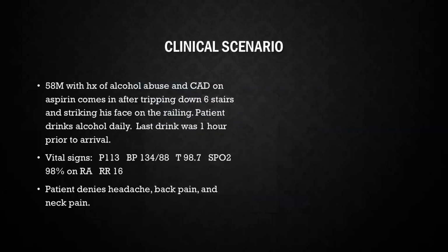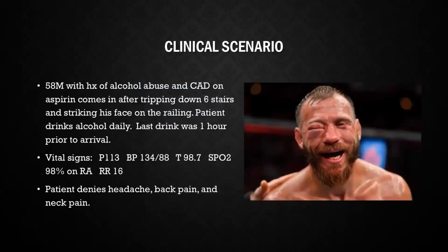So let's go back to our clinical scenario. We have our friend here, maybe one of our frequent flyers. He struck his face, his eye is swollen shut. There's really nothing else focal on exam, but you just can't get an exam of that eye because it's so swollen. Thankfully, this is a very happy drunk. He's very cooperative with what you want to do. So you're like, hey, I'm going to do an ultrasound of your eye. And he's like, yeah, let's go.